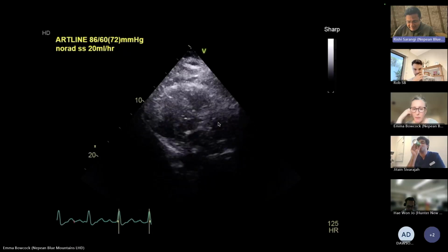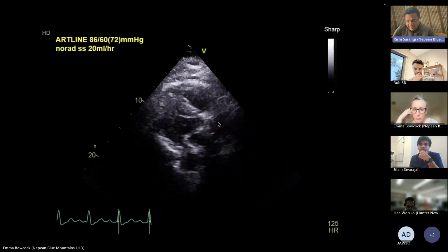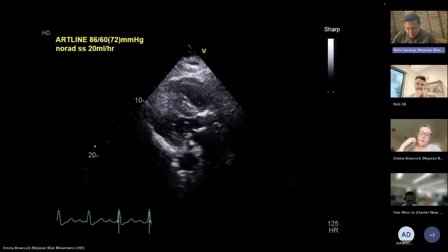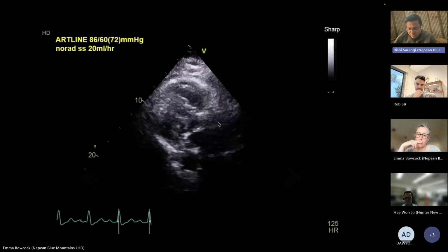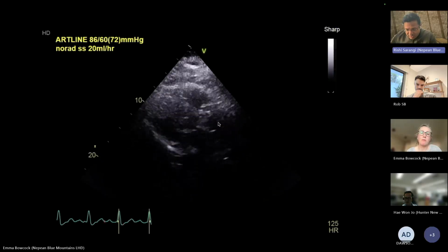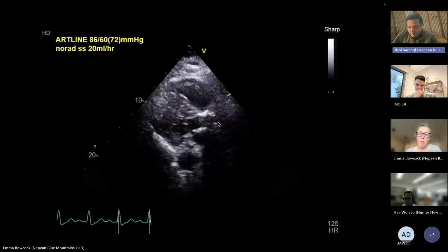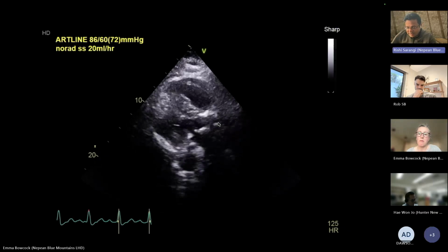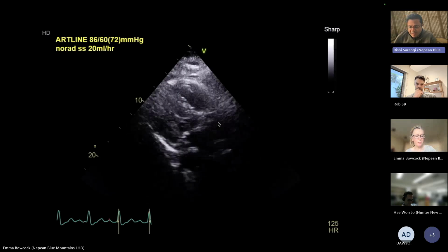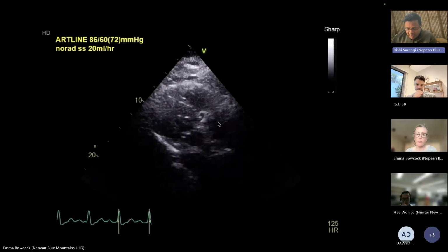The myocardial thickness, as you mentioned, appears to be concentrically thickened. LV function is hyperdynamic. There are no regional wall motion abnormalities in the inferoseptal and inferolateral walls that I can see, although the image quality is too low to comment well on that. I cannot see a good visualization of the mitral valve anterior leaflet, whether it's touching the basal septal wall, because I'm concerned in the clinical context that this patient might be having systolic anterior motion and LVOT obstruction.